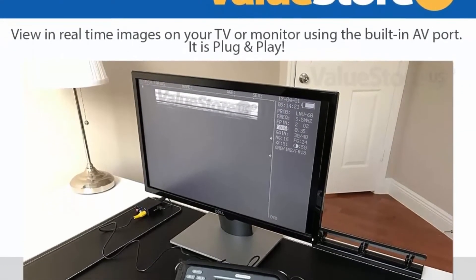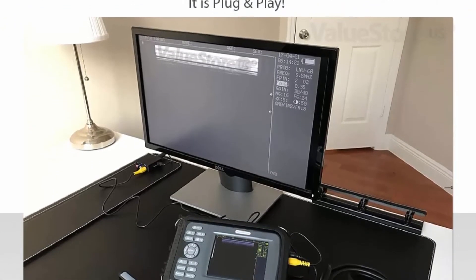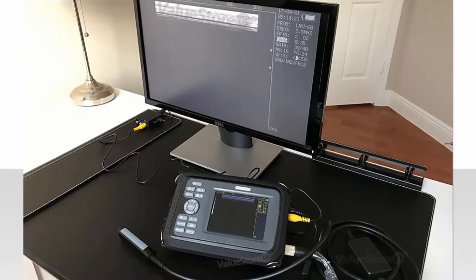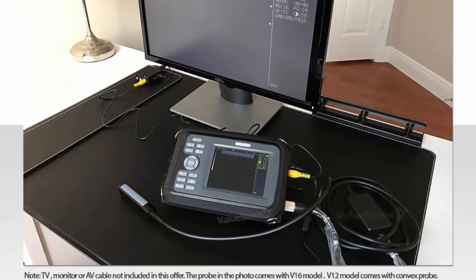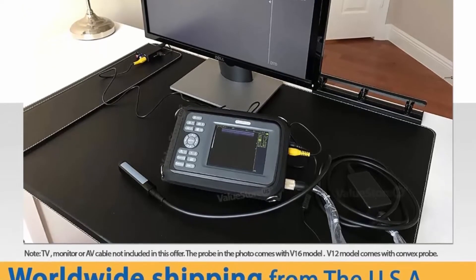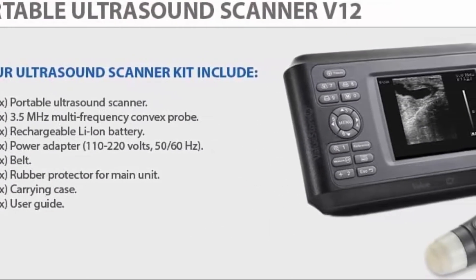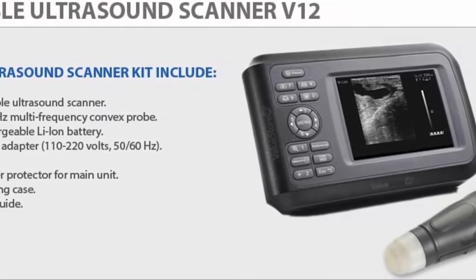It features a multi-color display and AV port to view real-time images on your TV or monitor of up to 42 inches, or to connect to a video printer. It is a standalone ultrasound which doesn't rely on apps for mobile devices to work. A standalone ultrasound will always work when you need it, whereas a wireless probe only works if the seller updates the app and is subject to hardware compatibility.